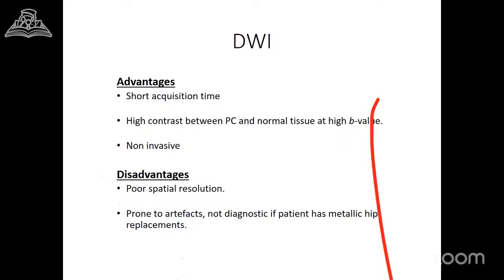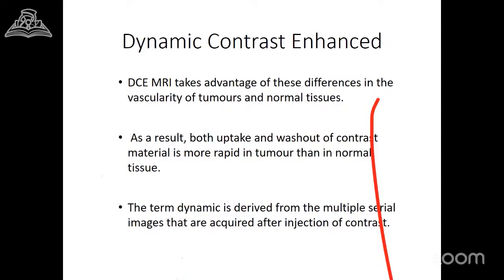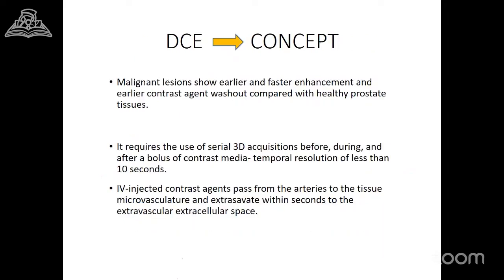Degraded in patients with metallic implants, such as hip replacement, making it non-diagnostic. The term dynamic refers to the repeated sequential imaging performed over time after contrast. Malignant lesions typically demonstrate earlier and more rapid washout compared to normal tissue.